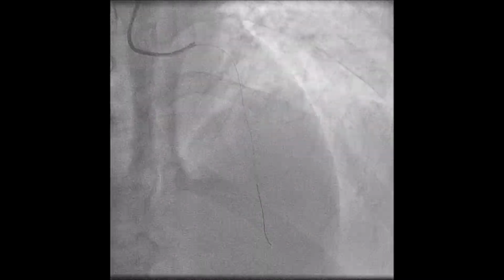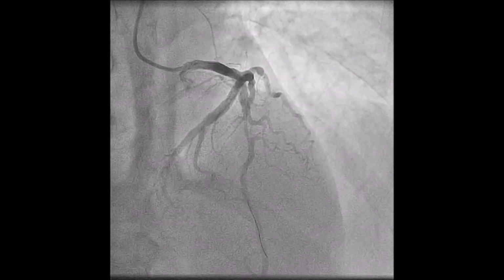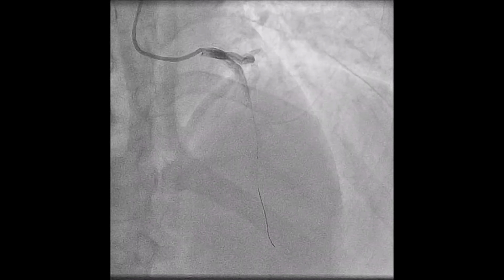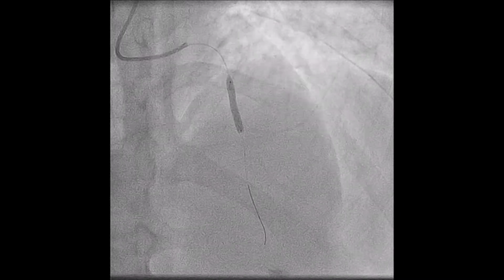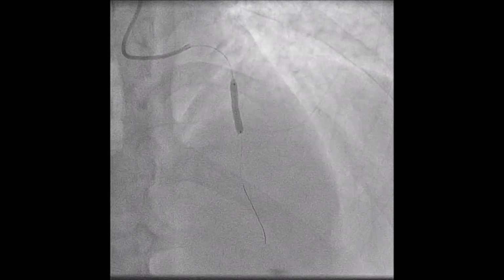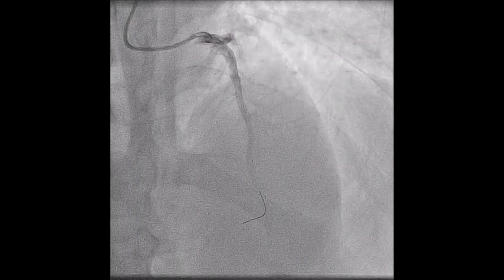First thing to do is to pass an angioplasty guide wire through the closure. Sometimes, as in this case, passing the guide wire partially opens the artery and allows us to see part of the distal bed. In this case, the next step was to implant a stent on the blockage zone. This props the artery and returns blood flow. And this is the final result.